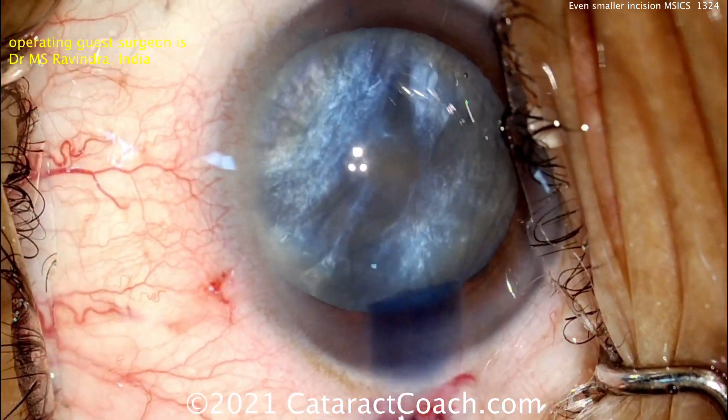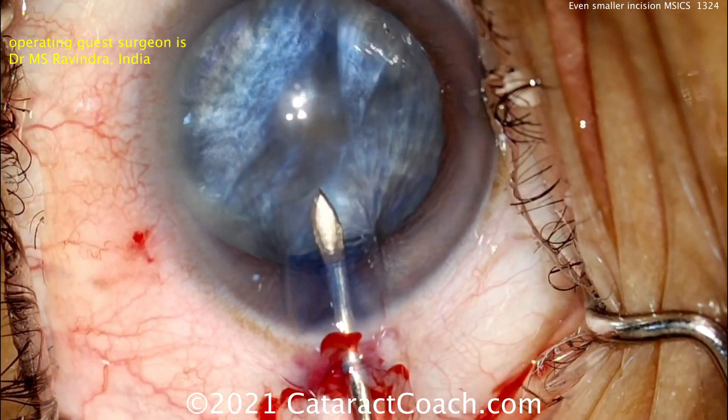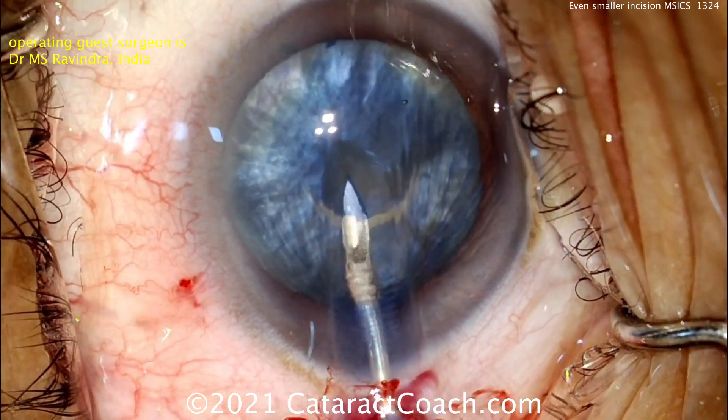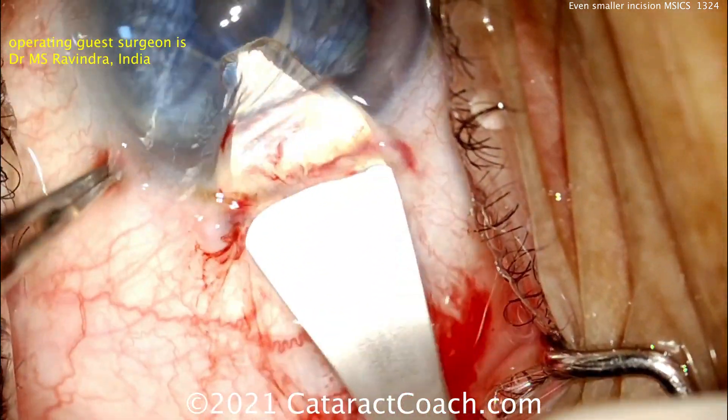I like how his incision has been created with a good tunnel length. Look at the trypan blue staining the stroma of the incision — very nicely done. Now using a sharp needle to decompress the capsular bag and incise that anterior lens capsule.